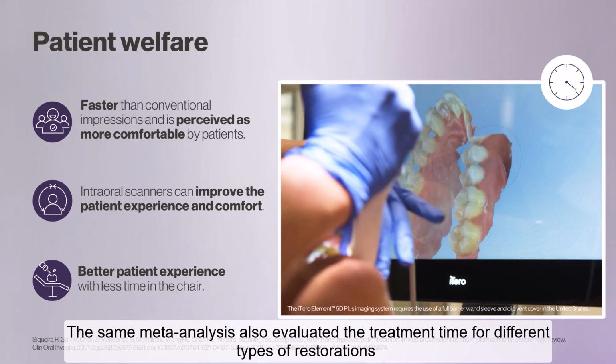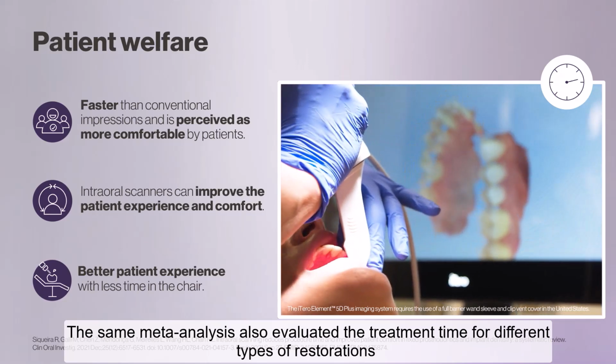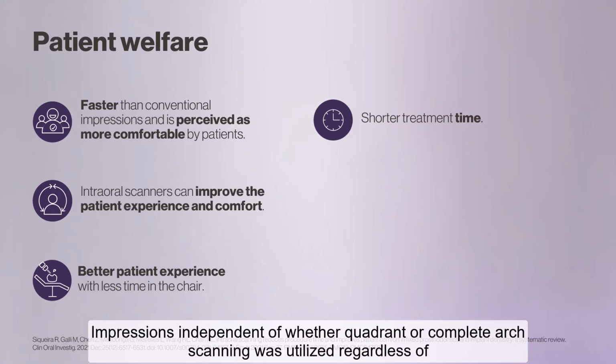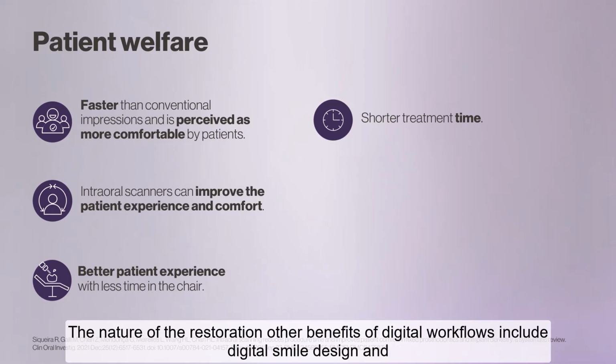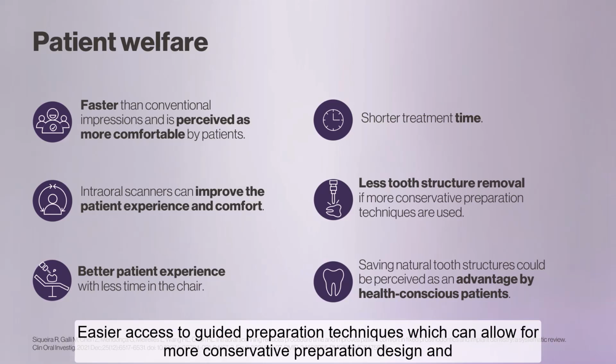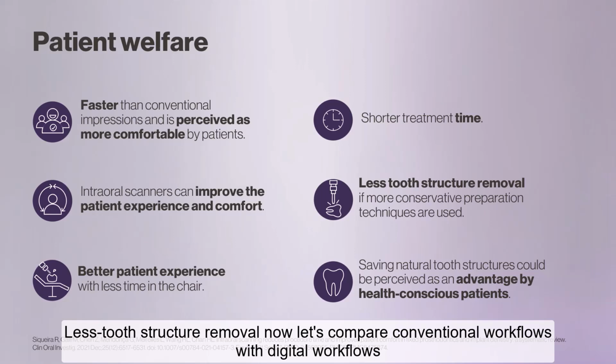The same meta-analysis also evaluated the treatment time for different types of restorations. The results demonstrated that intraoral scanner was faster overall than conventional impressions, independent of whether quadrant or complete arch scanning was utilized, regardless of the nature of the restoration. Other benefits of digital workflows include digital smile design and easier access to guided preparation techniques, which can allow for more conservative preparation design and less tooth structure removal.